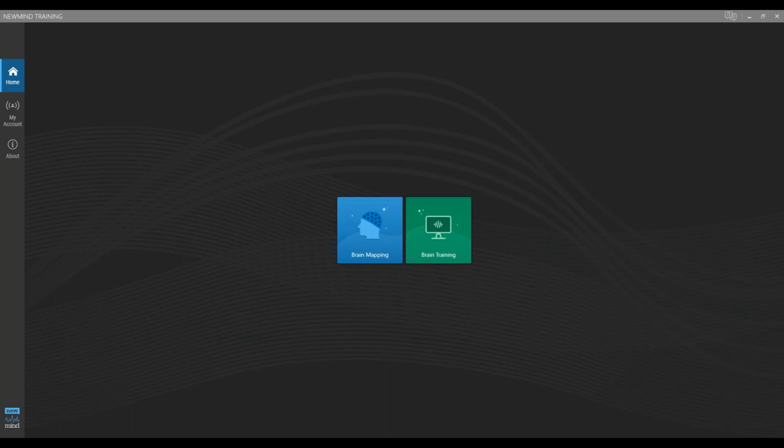And the fact that training efficiency is staying up is telling you that in between those events of artifact, they're actually training well. Our software ignores all the data when artifact is occurring, so it's not tracking amplitude of the signals, it's not tracking asymmetry.